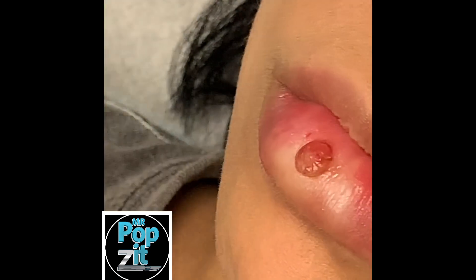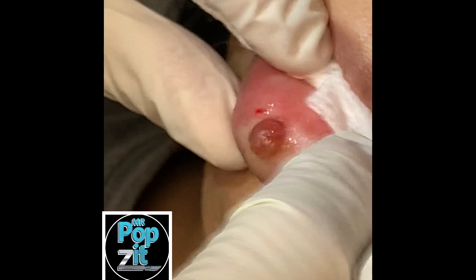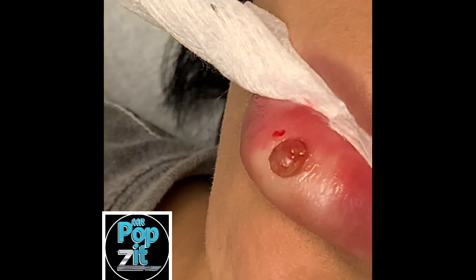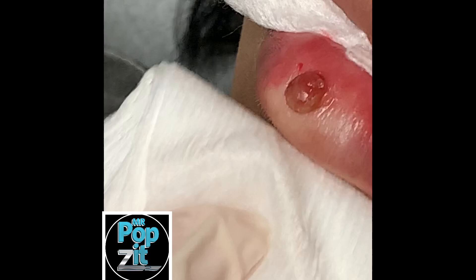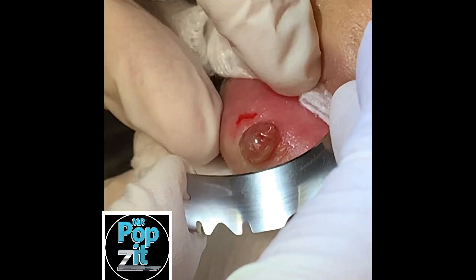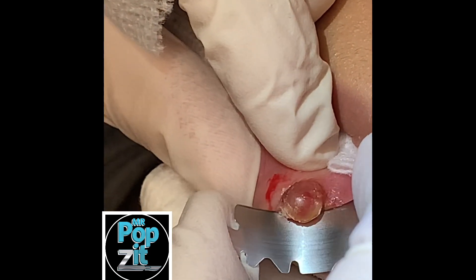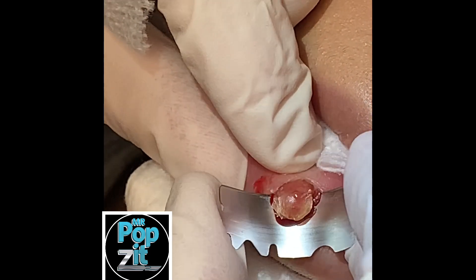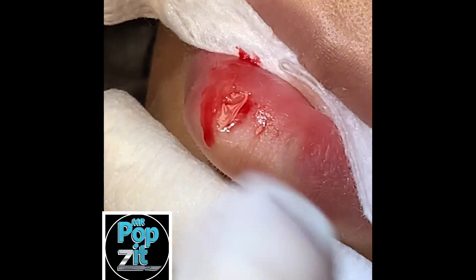I'm just going to have you open your mouth just a little. We're going to rest that little gauze in there and just turn the lip out. Perfect. 20 is good. Just be ready to apply pressure. We'll do a little shave biopsy right at the base — these always bleed a lot, but are easy to stop. Perfect.